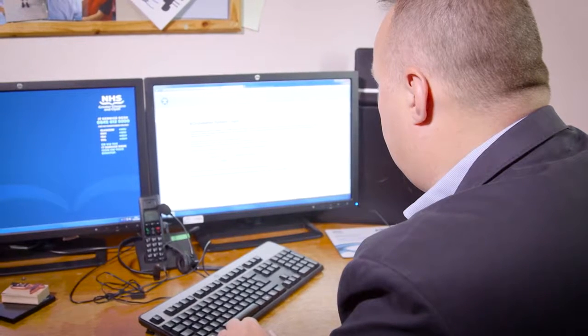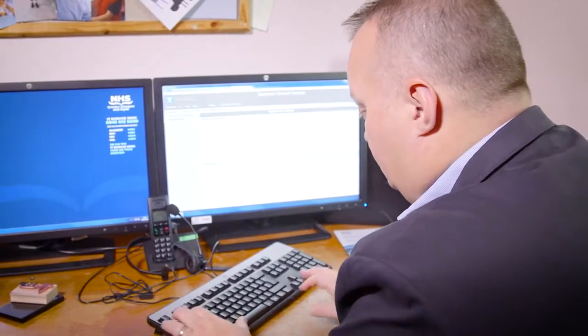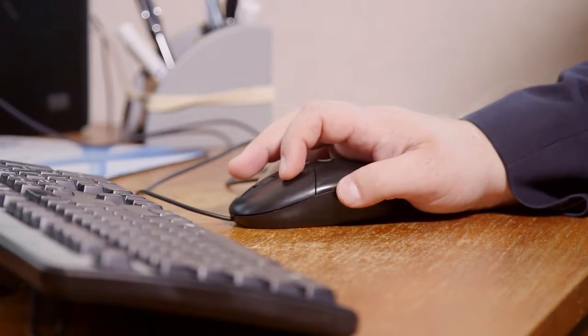Well, DiaSend is a system where no matter what the meter is, you can upload the results on your own computer at home before you come to clinic, or you can bring your meter in and upload all the information so you can see it all in one easy to use, easy to understand screen on your computer, and look at those together and look at averages and percentages and where the patterns are and discuss them.